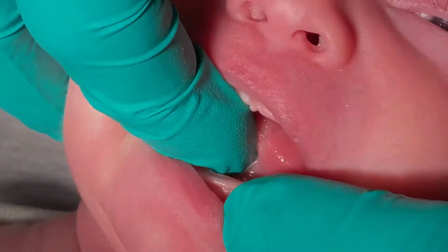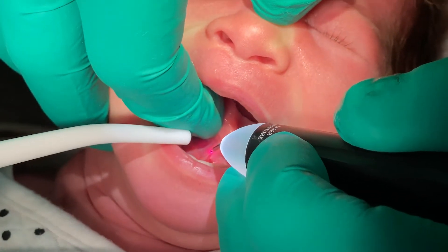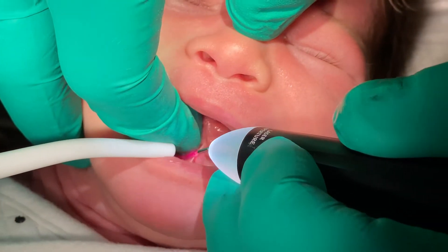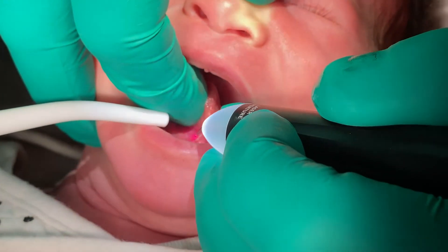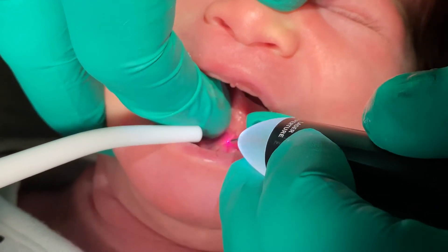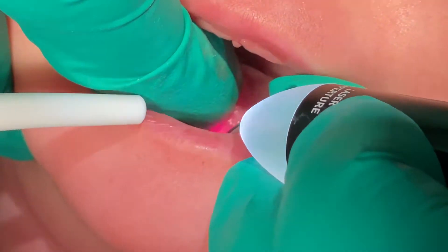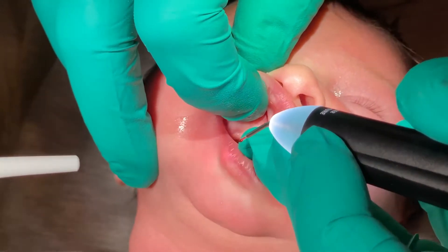We're going to make a little incision and give her some release. I'm going to go slow because I want to stay away from Wharton's ducts, which are right there. Riley's doing great, and you can see right away we got a release, which is great. She's not going to feel this — we gave her a drop of anesthetic.